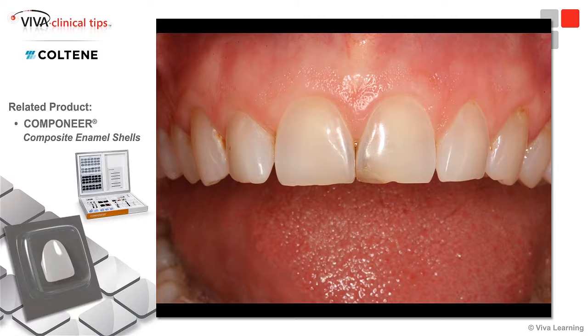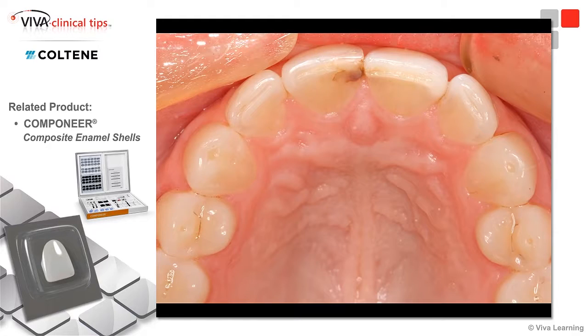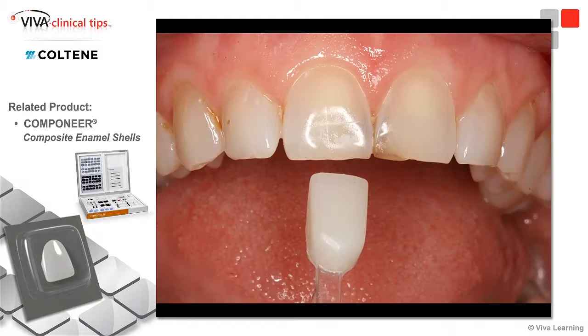This particular patient is interested in some kind of veneer for her 6 anterior teeth, and we chose COMPONEERs, or she chose them, after looking at her options. And here's the incisal view of that particular patient. And here is the Denton shade guide that we're using.